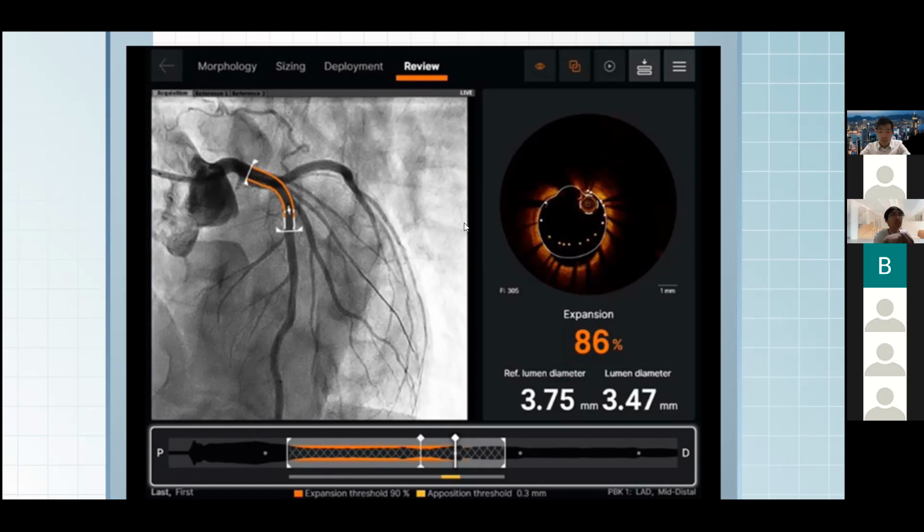And more than that, apart from interpretation of the images, they can also do 3D reconstruction at a better rate. And with 3D reconstruction, the artificial intelligence program can essentially perform different tasks, such as, for instance, identifying different sites based on the 3D reconstruction that might otherwise be very difficult for physicians to look for, or at least it is very time consuming.